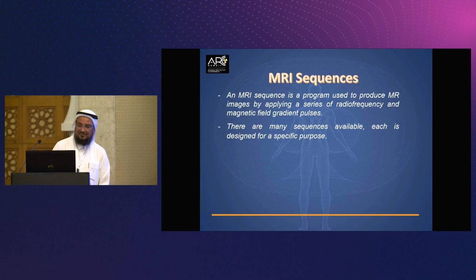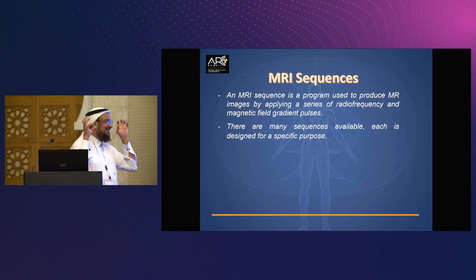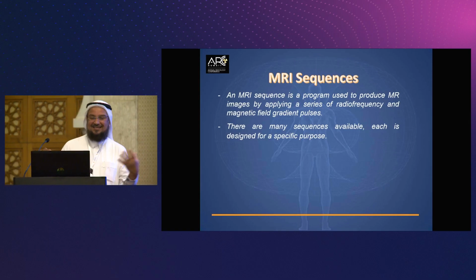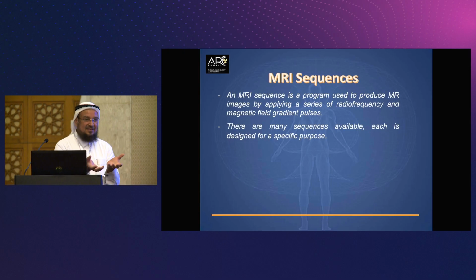Yes, good. We will start now about MRI sequences. I think since they're still capturing the information, it's better to hold them, so we will go directly. Now, we already know that the image is generated. But that was the simple way of acquiring the images. We have many, many ways.